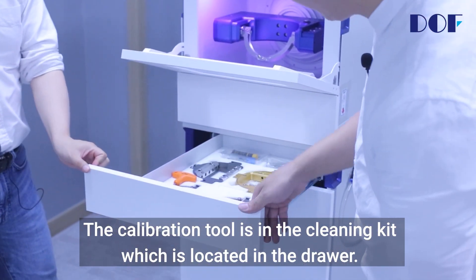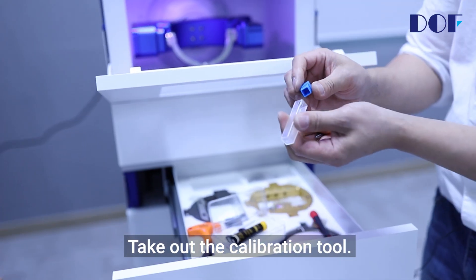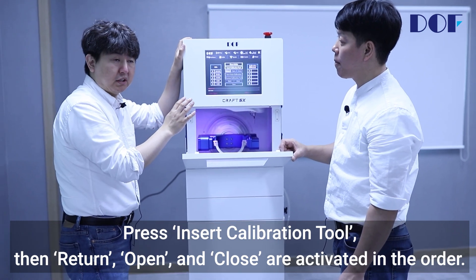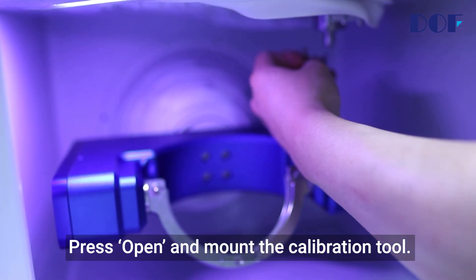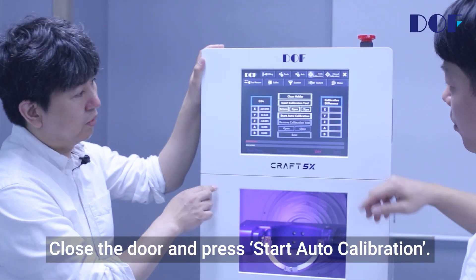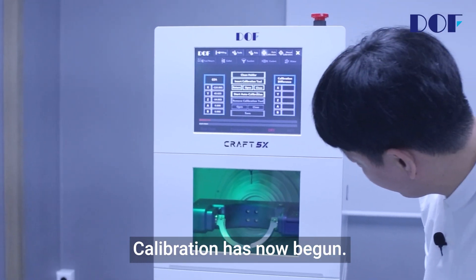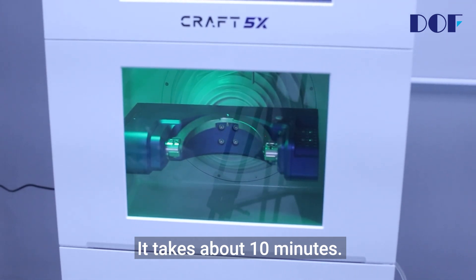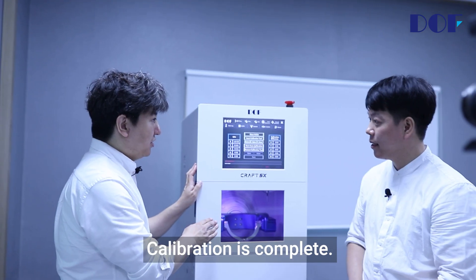The calibration tool is in the cleaning kit located in the drawer. Take out the calibration tool. Press insert calibration tool, then return, open, and close are activated in order. Press open and mount the calibration tool. Stick the magnet to the spindle body. Close the door and press start auto calibration. Calibration has now begun — it takes about 10 minutes. Calibration is complete.